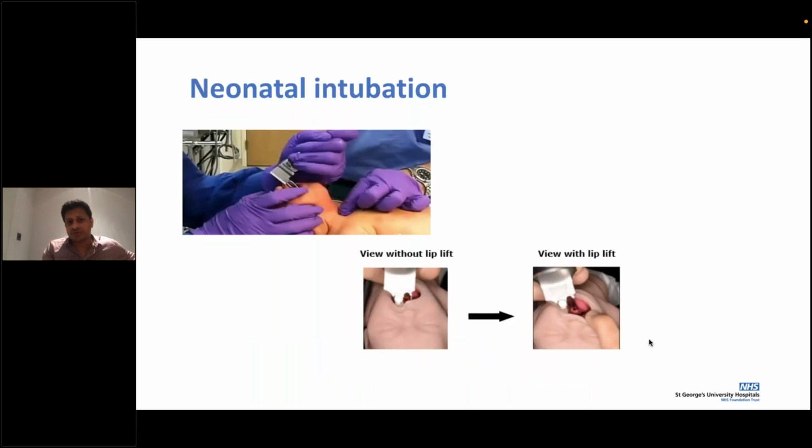Now, once you proceed with your intubation, you're really looking at your view. Try and just make sure you're not impeding the upper lip. Upper lip injury is very common. Try and save that upper lip, because they bleed very profusely if injured, and in that case it may obstruct the view with blood. So it's important that you have a good view.